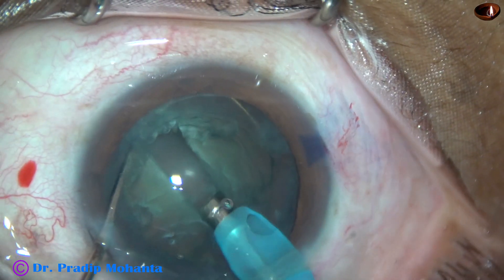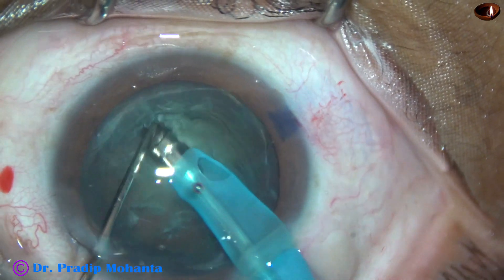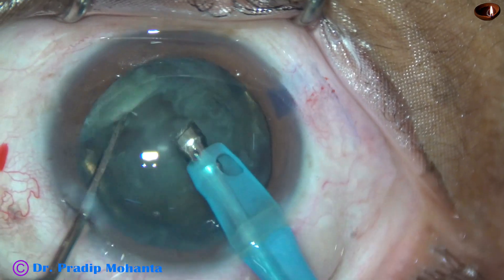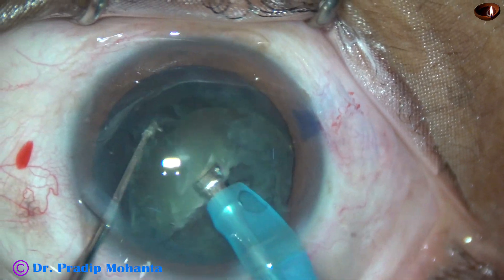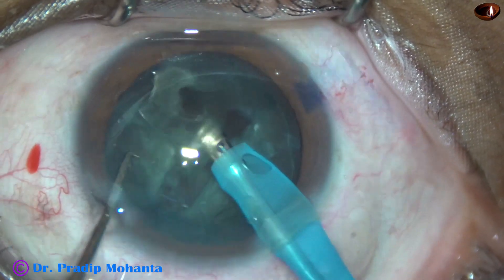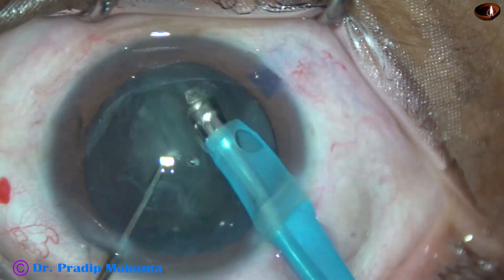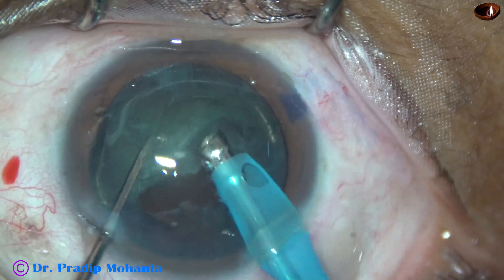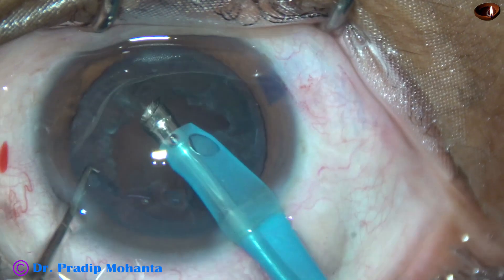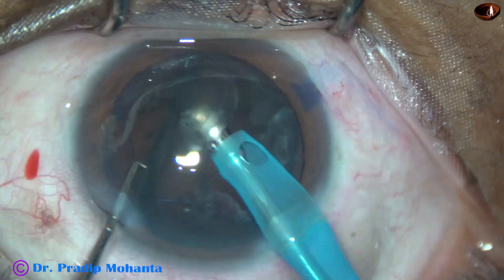So we must use the ultrasonic energy — cut and move. Now, this is the division of the nucleus into two hemi-nuclei. Each hemi-nucleus is then chopped into smaller pieces using higher vacuum. I am using 400 mmHg vacuum at this time with 40 ml per minute flow rate, and the two hemi-nuclei are removed in no time.